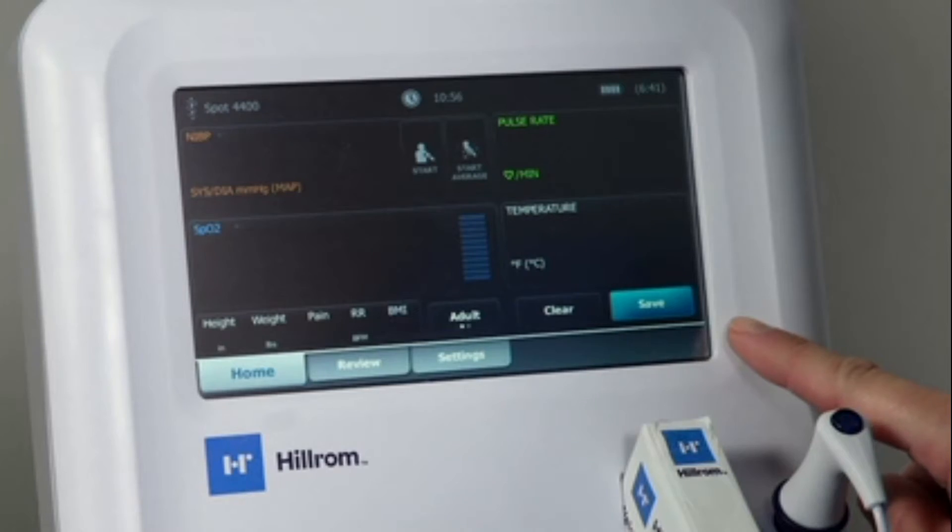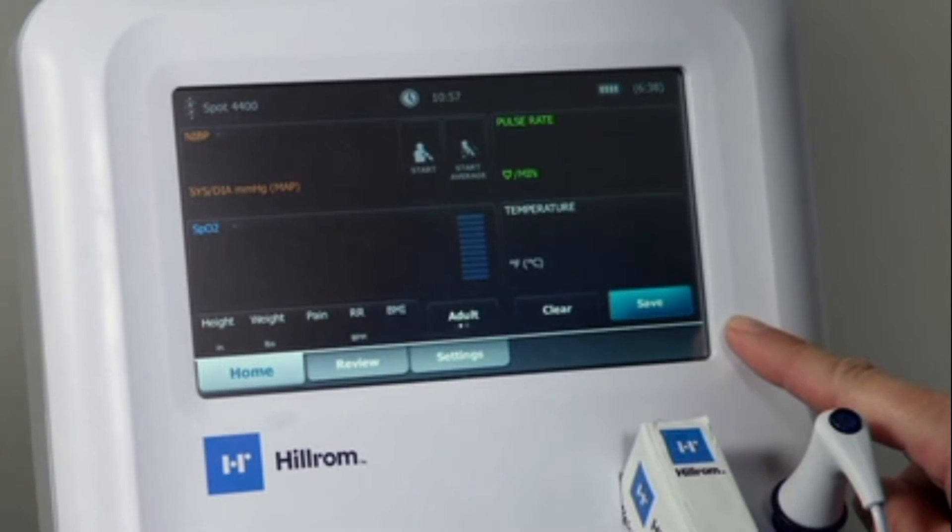At the bottom of the device screen, you will see the navigation area. These tabs allow you to navigate through the device menus to review details and access additional setup functions or service information. For a walkthrough of device tabs and settings, check out our device navigation video.